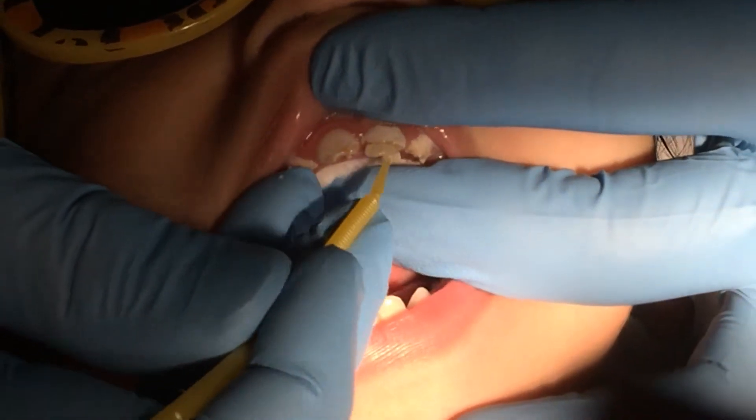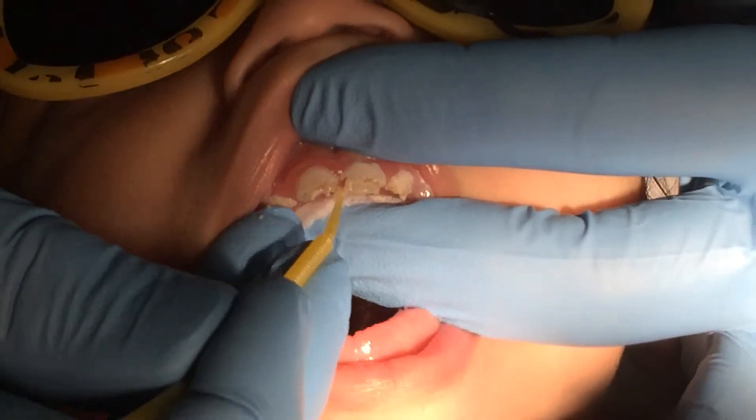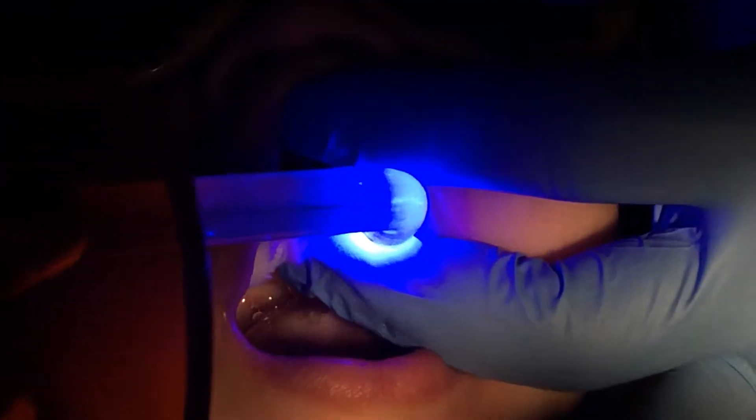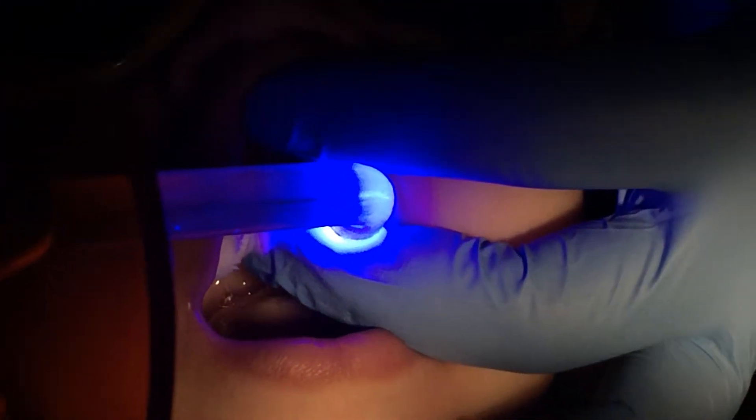And we don't really have to do that, like here. But doing so just allows us to develop the color that's going to be developing.